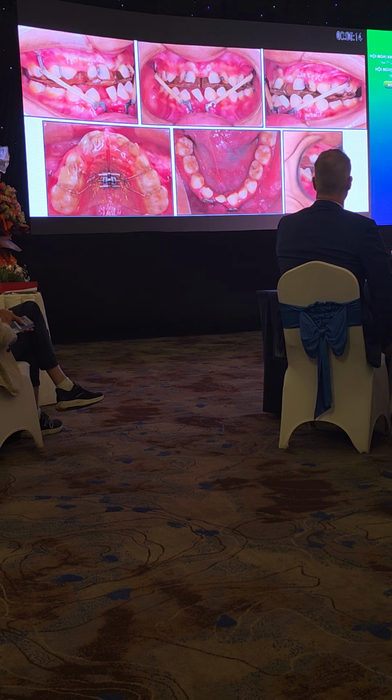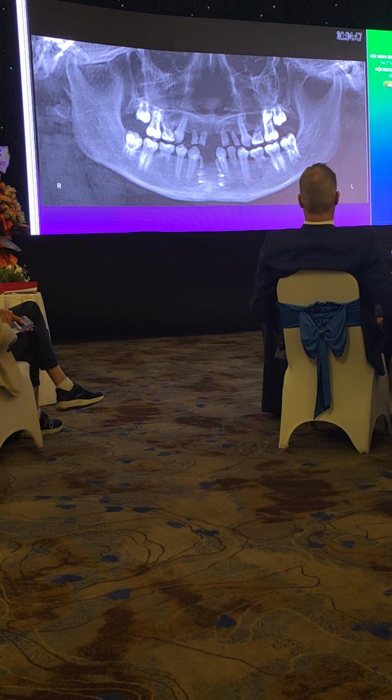You actually don't need 16 ounces of force, because those are called heavy intermittent force. Right? So patients wear the face mask at night for about 10 to 12 hours, with 16 ounces on each side. But you can offer the patient an alternative. Alright? You wear it for 24 hours and you don't need to wear the face mask. So that's what we offer for this patient.